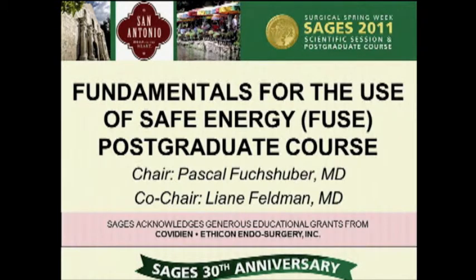I would say in pediatric surgery, the most common error I see people making, and the one that I emphasized, is people get the dispersive electrode wet on a child, because you cannot sloppy prep a child, and they're so small that either from your irrigation, from fluid drainage, or from your prepping, the dispersive electrode gets wet. Most of the time you won't get into trouble with that, but if you do end up getting a burn, it can very easily in a neonate be circumferential and they're suddenly critically ill. And I think the other error that people make in pediatrics is they just don't think to check their settings before they start, and then somewhere mid-case people will say, oh, what are our settings on?